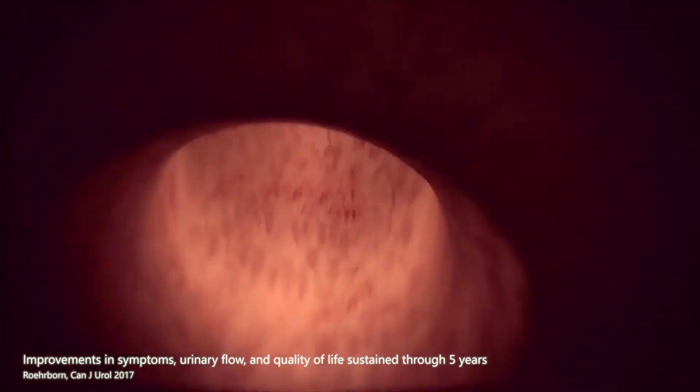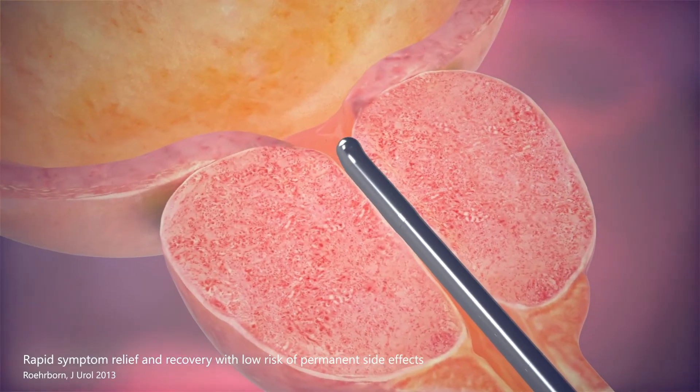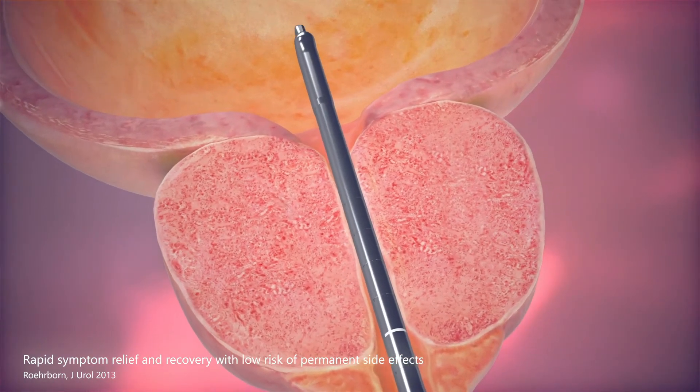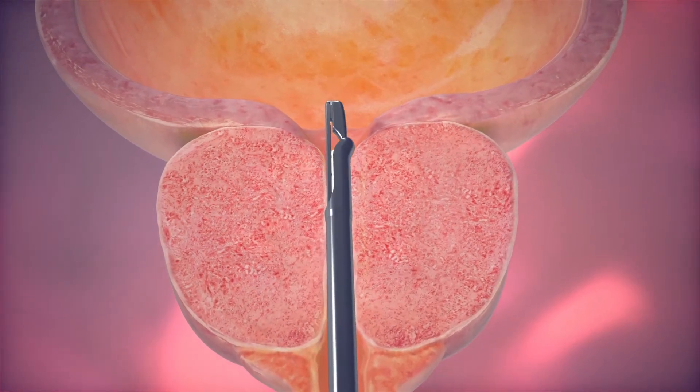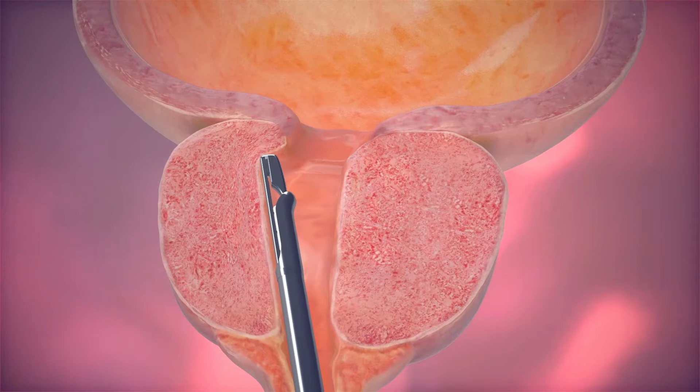The UroLift system treatment is often performed in a clinic setting under local anesthesia. The procedure begins by inserting a delivery device into the urethra. An inserted cystoscope provides the physician with visibility to the anatomy. On reaching the area of the urethra blocked by the enlarged prostate, the obstructive tissue is moved aside.